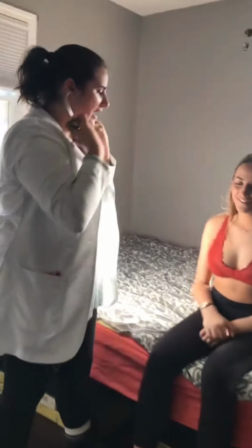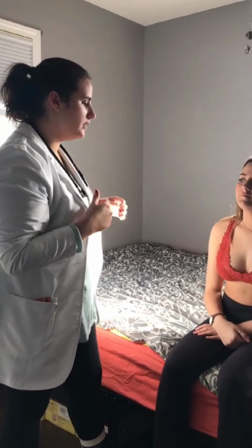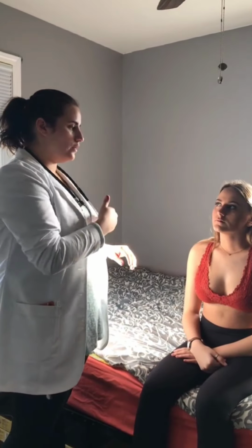Okay, good. I didn't hear any adventitious breath sounds. They were all clear. Since we're working on the front, I'm also going to do the heart sounds while we're at it. With the heart sounds, we use the APE-TO-MAN mnemonic. It's aortic on the right sternal border in the second intercostal space. If we go right over to the other side, on the left sternal border, second intercostal space, also known as the pulmonic heart sounds.